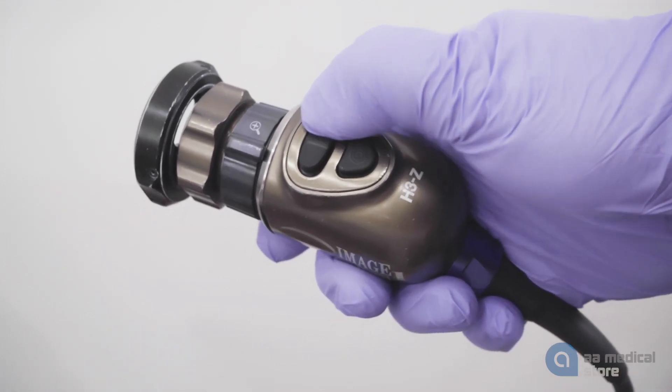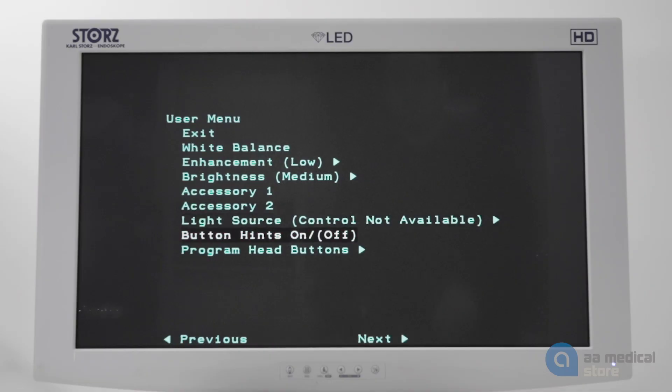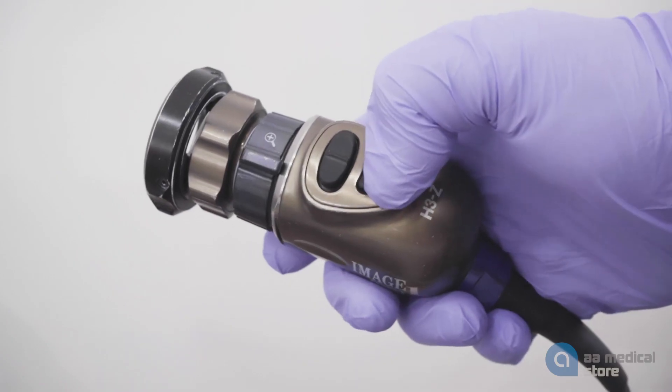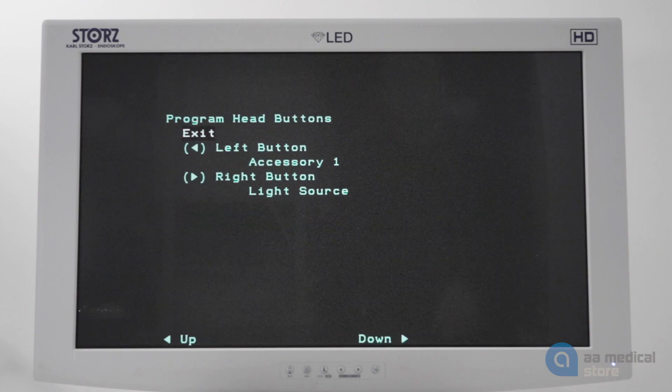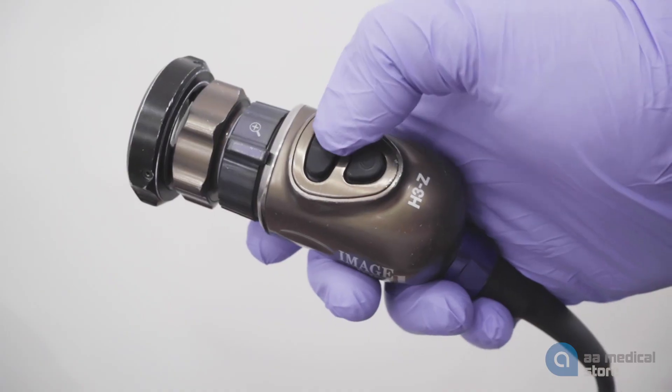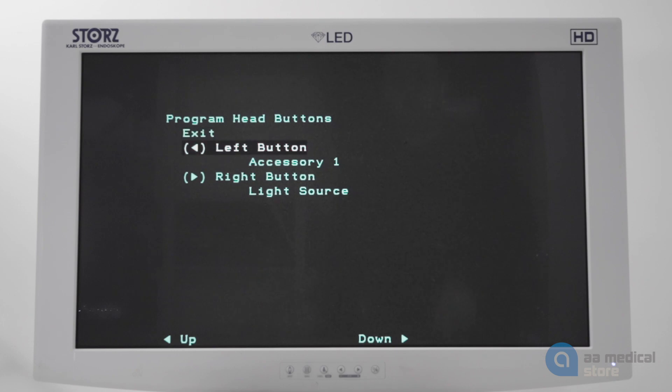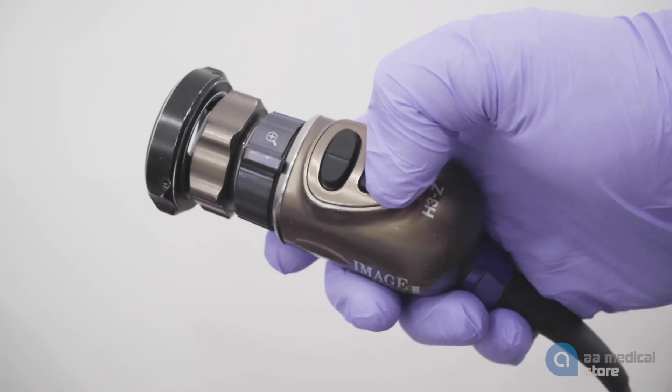Press the right button to scroll down to the program head buttons option and then press the center button to open the menu. Select left button.